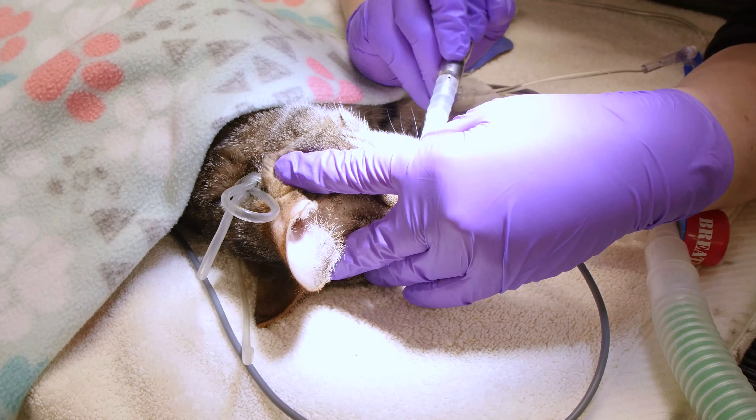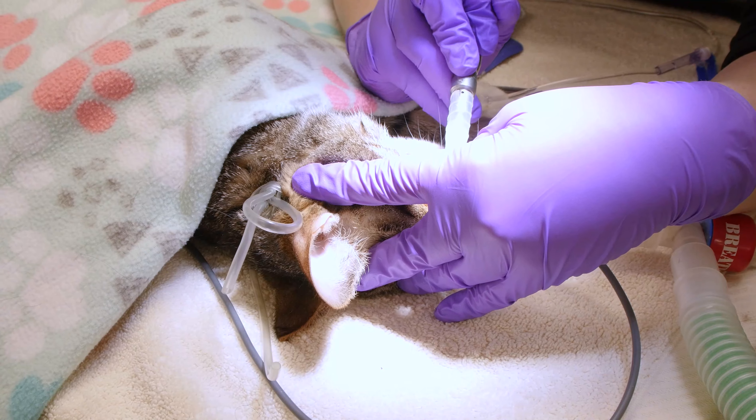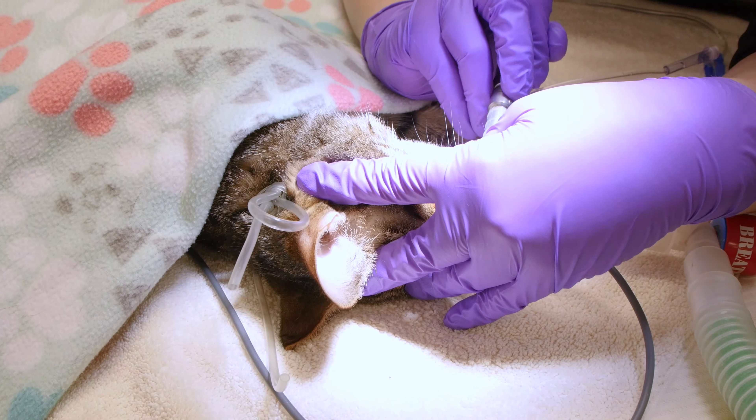Depending on the size of the tooth, the veterinarian may create a gingival flap, which will allow access to the bone and root surface. If the tooth is multi-rooted, it will be sectioned, and the veterinarian will remove the roots and tooth and close the gingival flap with absorbable dental sutures. The teeth will then be polished to remove any microscopic scratches and decrease the rate of bacteria sticking to the teeth or plaque buildup.